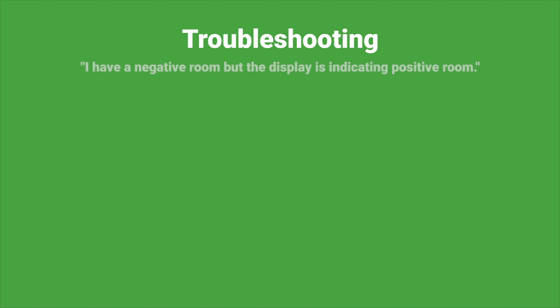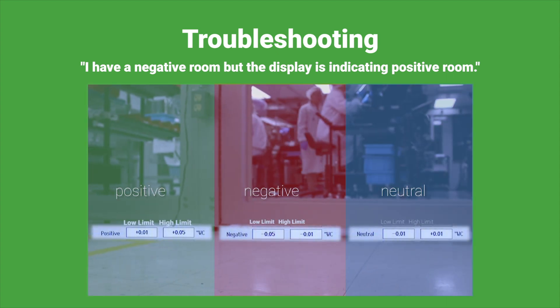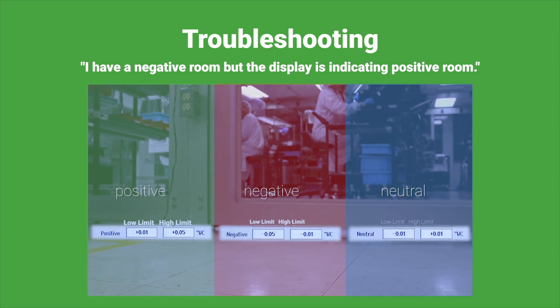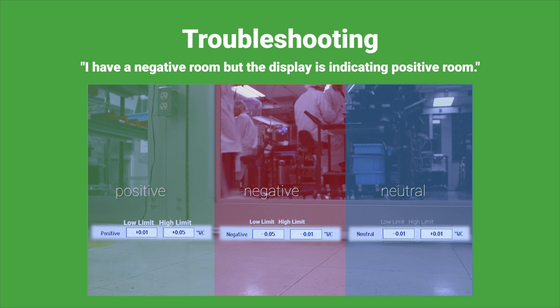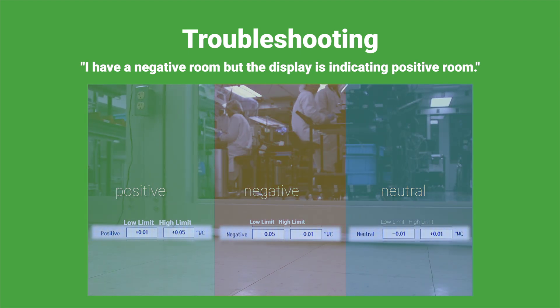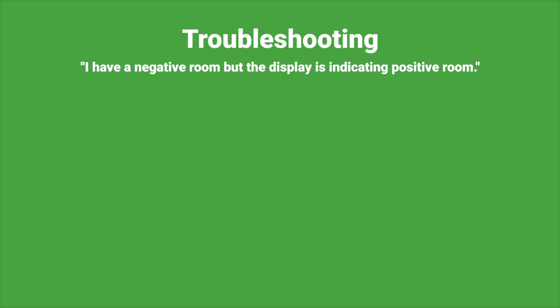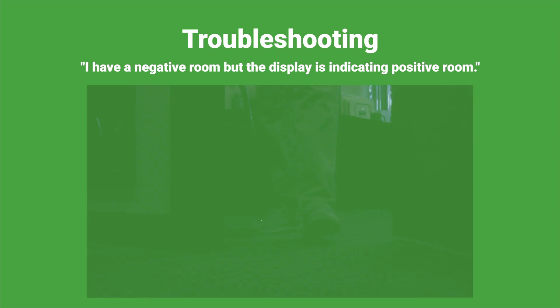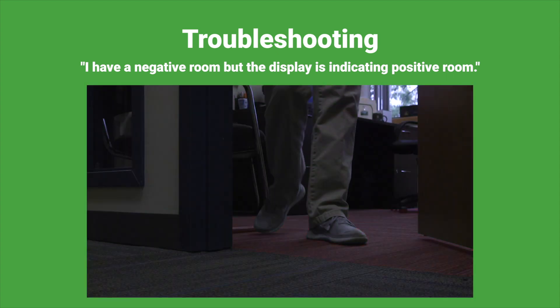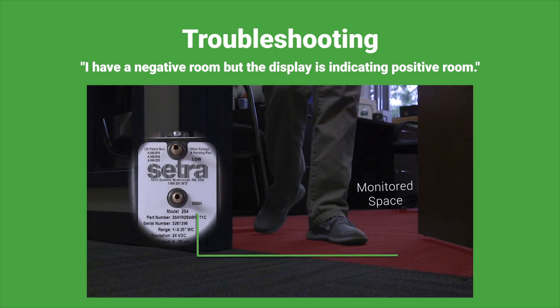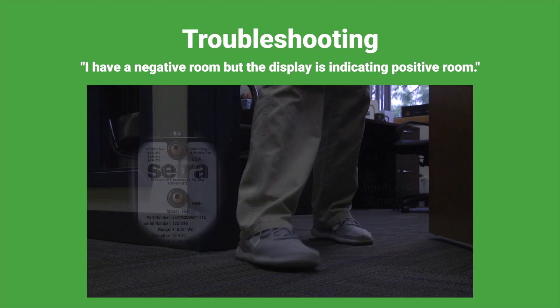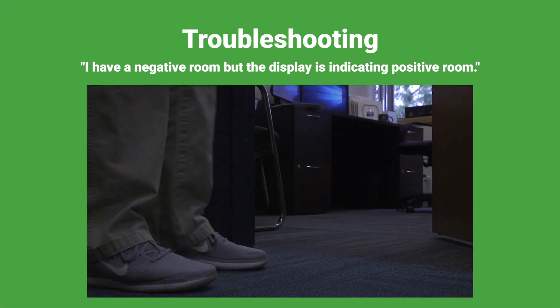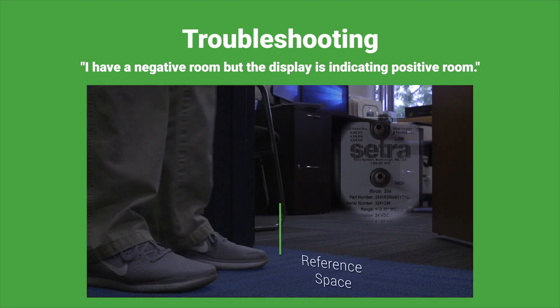Troubleshooting: I have a negative room, but the display is indicating positive room. Check the alarm set points and make sure they correspond to the proper kind of room. Also, be sure the unit is plumbed correctly so that the high or positive port is plumbed to the room being monitored and the low or negative port is plumbed to the reference space.